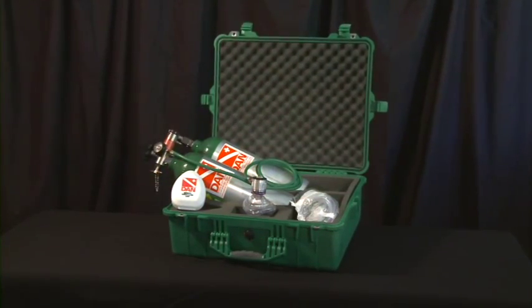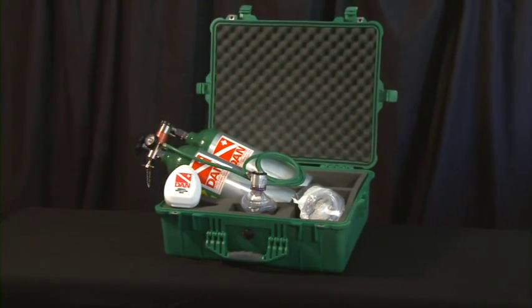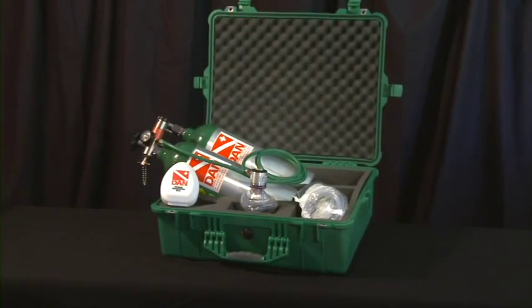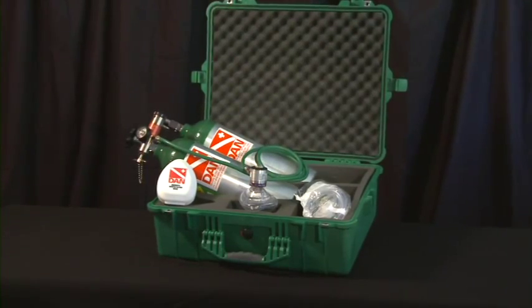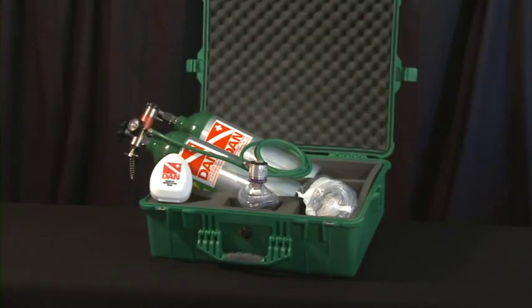How you store your oxygen equipment is important so that it's ready to use in an emergency. Assembly and disassembly of the oxygen equipment is also important so you'll be able to clean the unit and be comfortable and confident in its use.